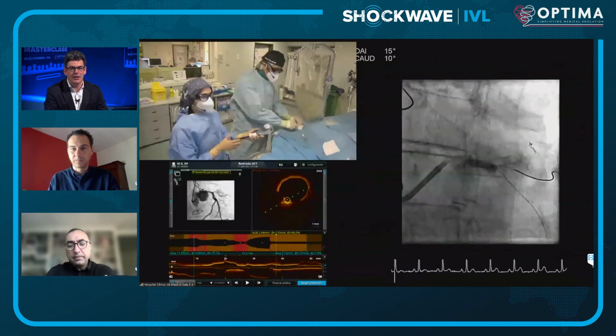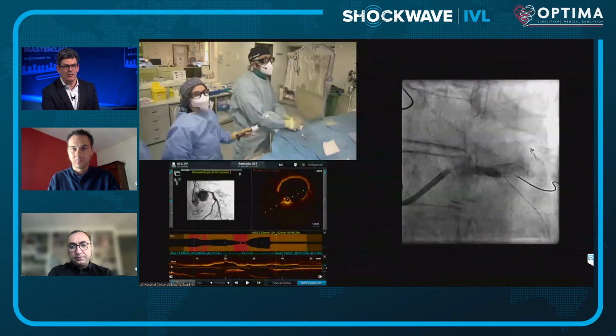So this is an NC balloon, 4.0. Would you be satisfied with this expansion here? I think the expansion is really good. I like Javier's technique of following it with a non-compliant balloon. While I love shockwave for the fact that it avoids us using high pressure, I think we have to be realistic that sometimes we treat very difficult and complex lesions where the shockwave will do the hard work of putting those cracks in the calcium. But I often find that I have to then follow it on with something else.